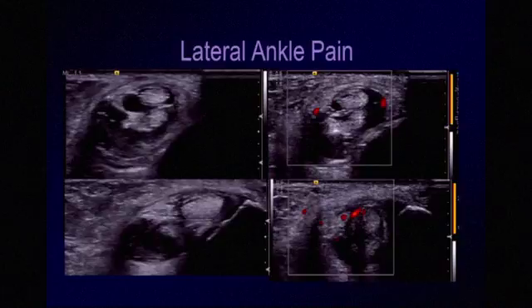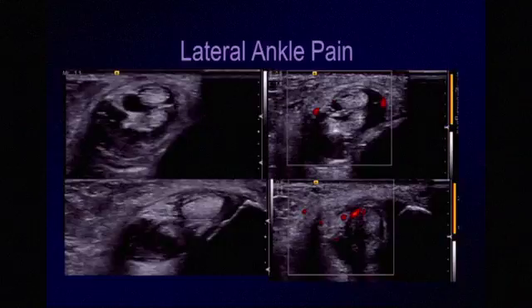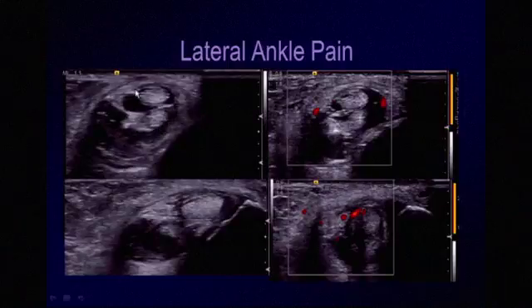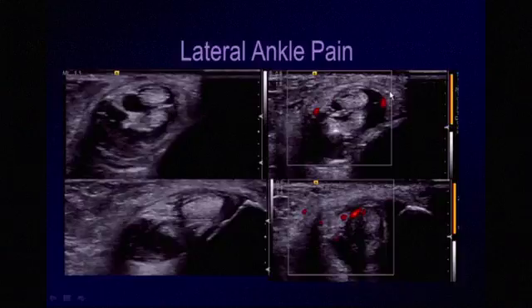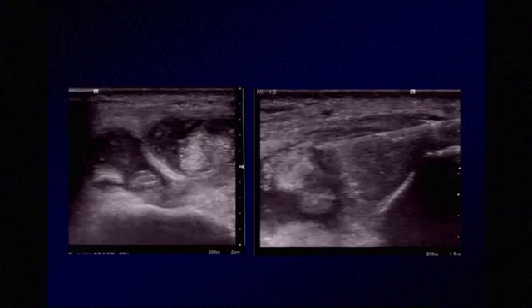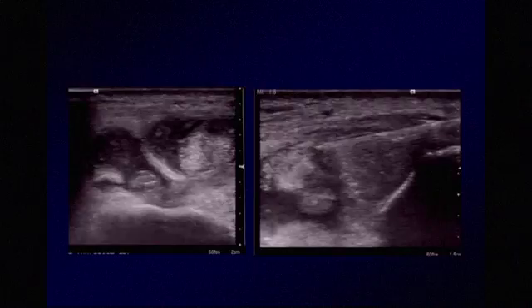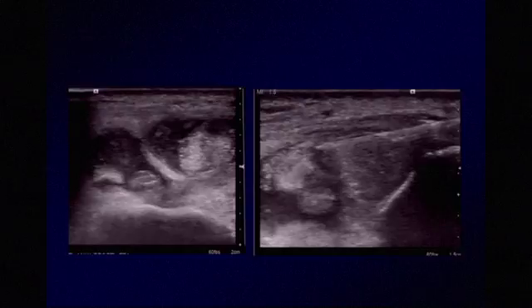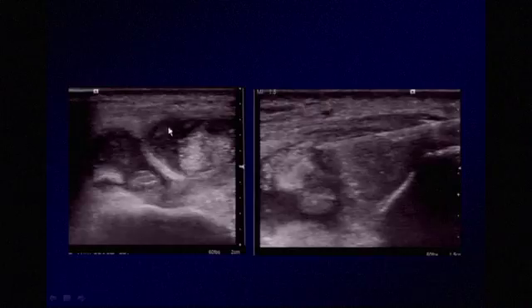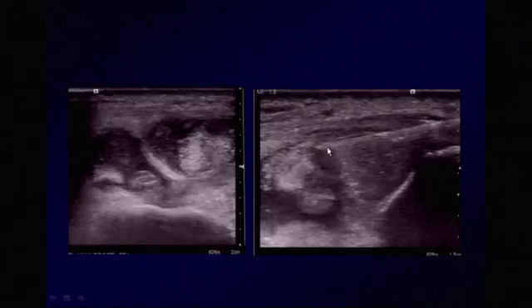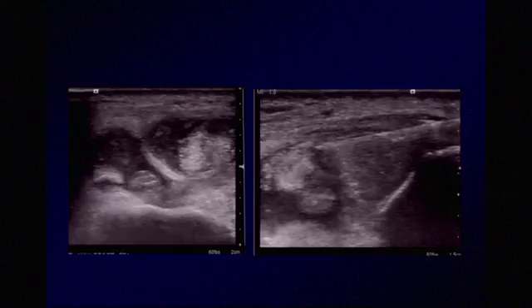This patient presenting with lateral ankle pain has tenosynovitis involving the peroneal tendons. We see the peroneus longus and brevis within their tendon sheath surrounded by fluid, with increased vascularity on power Doppler, thickening of the synovial sheath, and decreased echogenicity or heterogeneity of the tendons. An intervention can be performed — this is an injection into the peroneal tendon sheath, with the tendons enlarged and hypoechoic, surrounded by complex fluid. The needle is viewed in-plane with a linear transducer as it inserts into the tendon sheath.